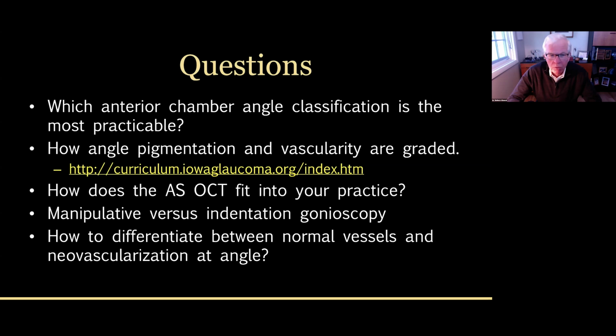These first two have to do with how you grade things. There are several grading systems: the Spaeth, the Shaffer. I really like the Spaeth system beyond what I can talk about in this lecture. But if you go to my curriculum website, there's a gonioscopy talk where I go through the Spaeth system. The Spaeth system describes not only the width of the angle, but also the height of the iris insertion and the shape of the iris. So I think it's harder to learn, but it's really useful.